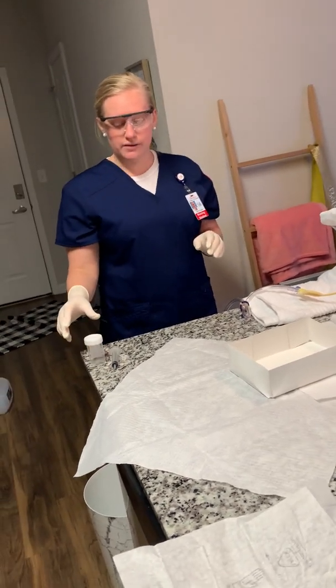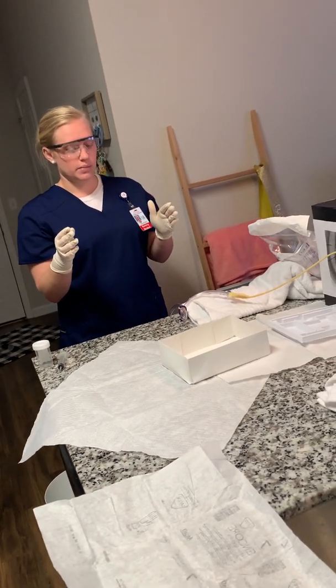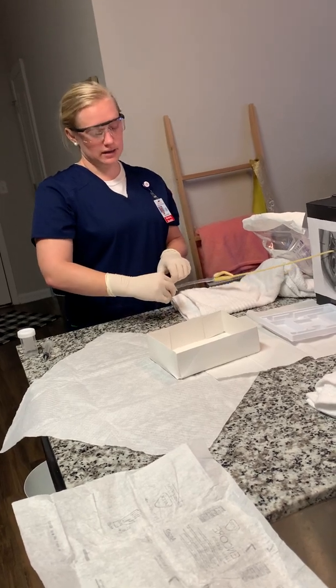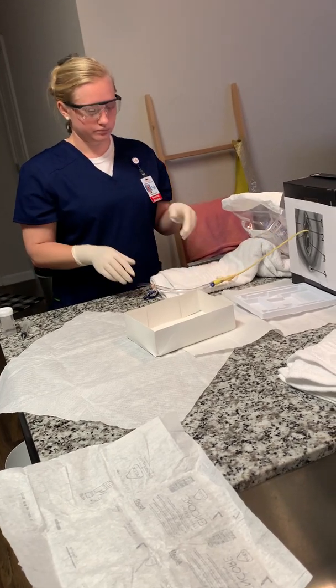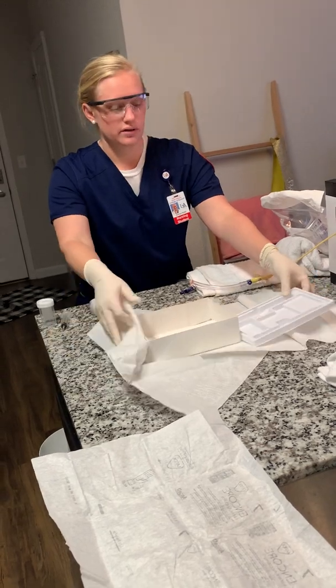So after I've collected the specimen I need, I can clean up my space. But I also want to make sure to unkink this because that could really harm my patient. So I'm going to unkink it. Okay, so now I can clean up my stuff.